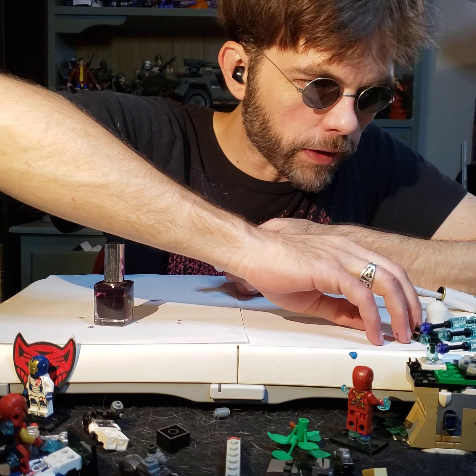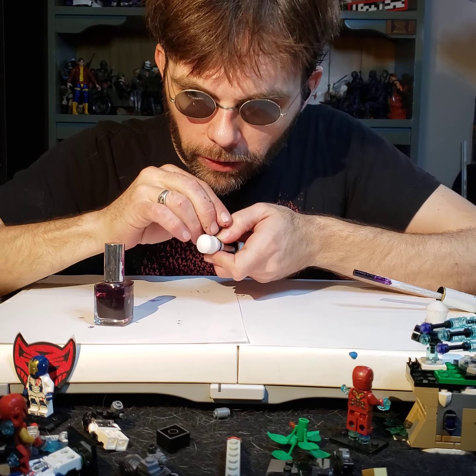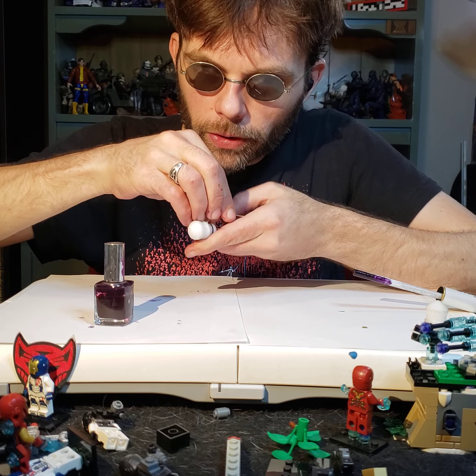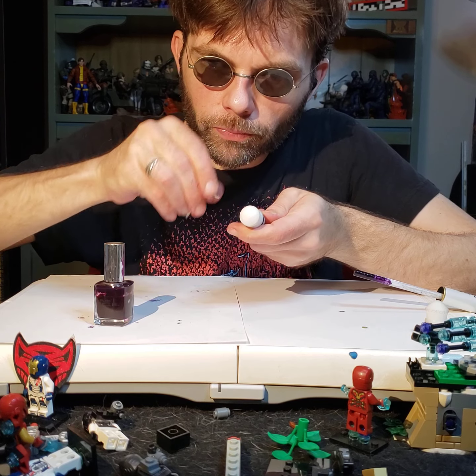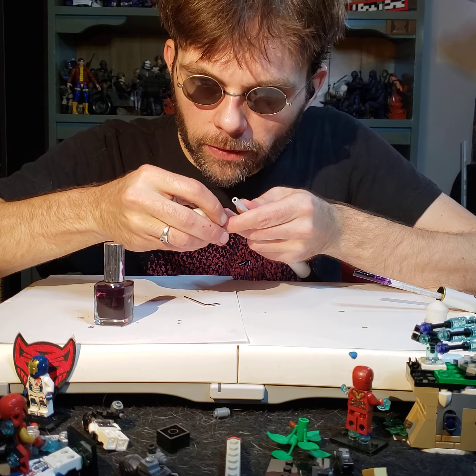Now, come over here, feel around for my little bitty Allen wrench. Found my little bitty Allen wrench. I'm going to put the Allen wrench in here, and we're going to give it a full 2. That's 1. That's 2 rotations. We're done. 2 rotations. Is that enough? Yes, 2 rotations is enough.